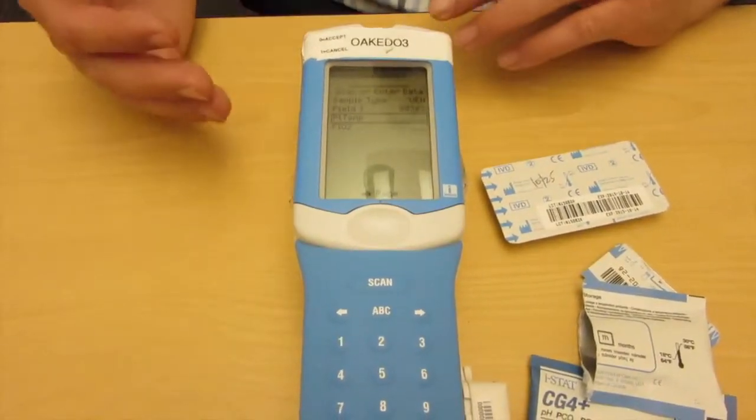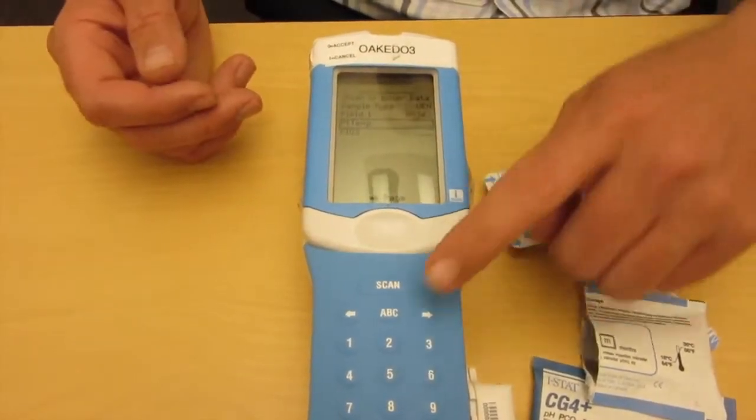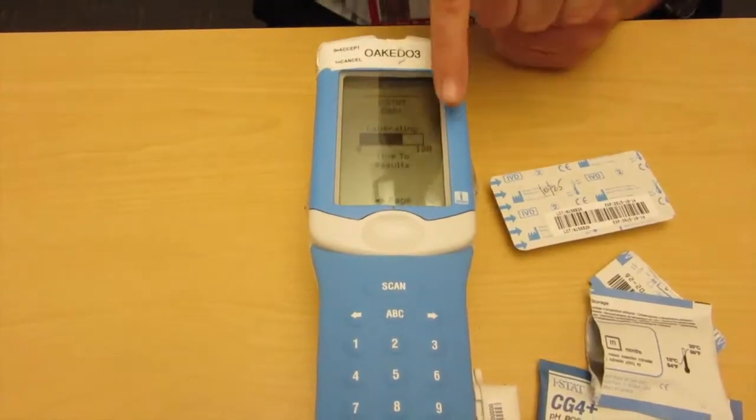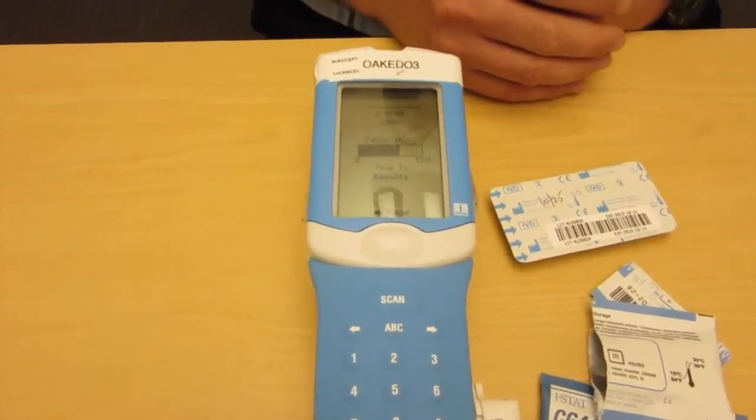Press enter. If I'm not doing an ABG where FiO2 and temperature are required, I would go ahead and press page over. Then we wait — you can see the 120-second countdown timer already happening, and we're almost ready to go.